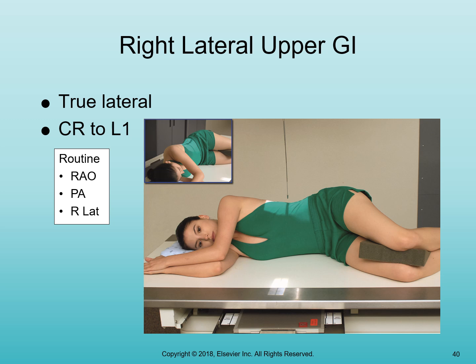Patient's lying in a complete lateral position, meaning their back is straight, shoulders on top of each other, hips on top of each other, and you are centering to the level of L1, which is now found 1 to 1.5 inches above the lower border of the ribs.